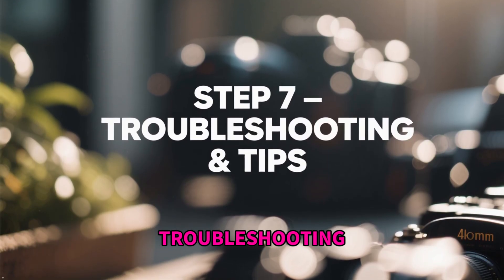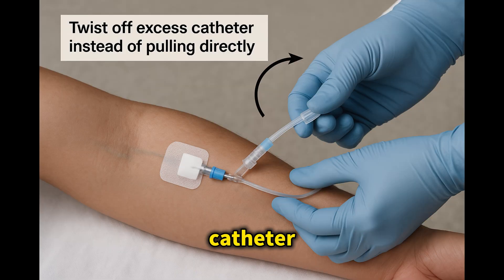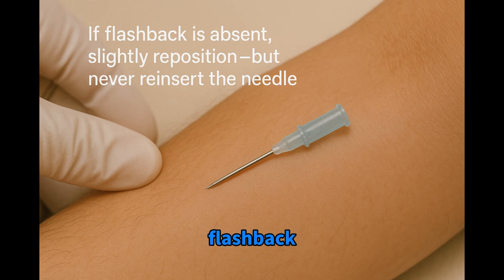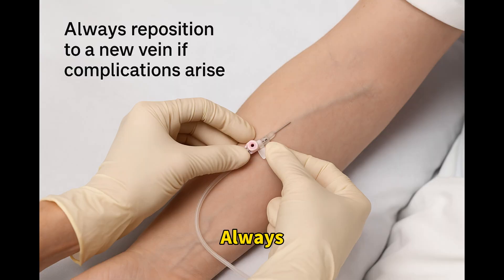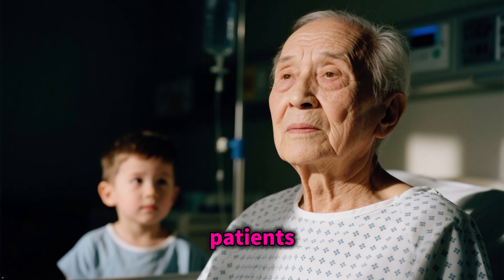Step 7: Troubleshooting and Tips. Use a 10 to 20 degree angle on small or fragile veins. Twist off excess catheter instead of pulling directly. Stabilize the catheter hub while flushing. If flashback is absent, slightly reposition but never reinsert the needle. Always reposition to a new vein if complications arise, and always follow your institution's guidelines — especially for pediatric or elderly patients.